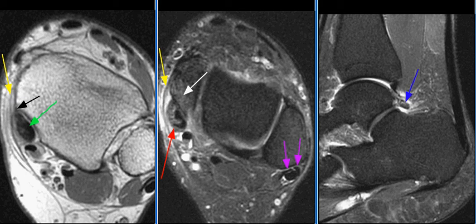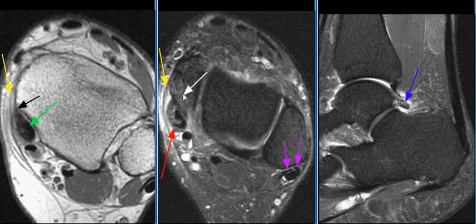This is a 55-year-old female with history of ankle pain. MRI examination of the ankle shows severe tendinosis of the tibialis posterior tendon with high-grade partial tear at the level of the medial malleolus, as seen on this image with the red arrow. There is tenosynovitis and reactive osteitis along the malleolar groove.